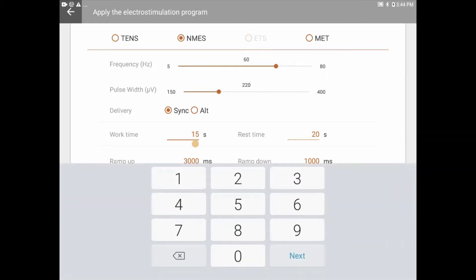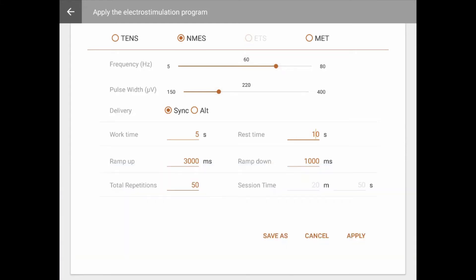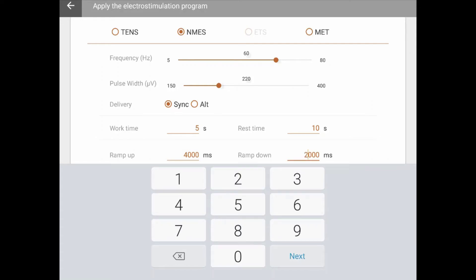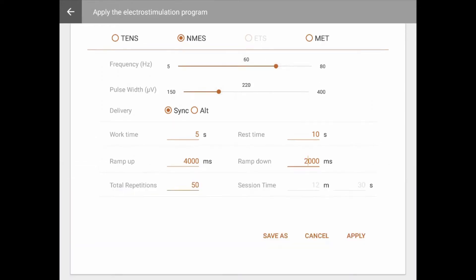NMES programs include work and rest phases. Click on the values displayed to edit the phase's length. Click anywhere on the screen to close the dialog box. You can select and edit the current's ramp up and ramp down times. You may also edit the total session duration or the number of cycle repetitions.